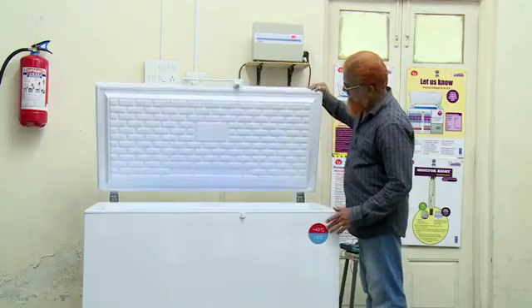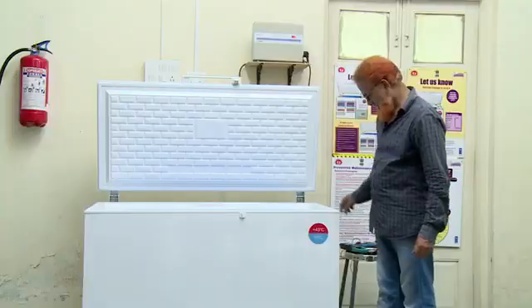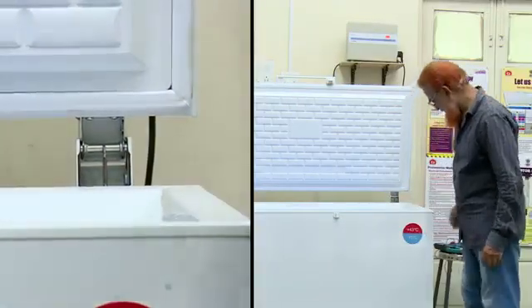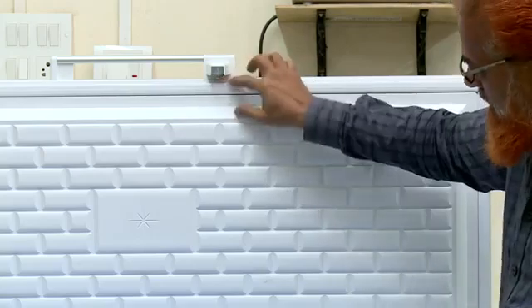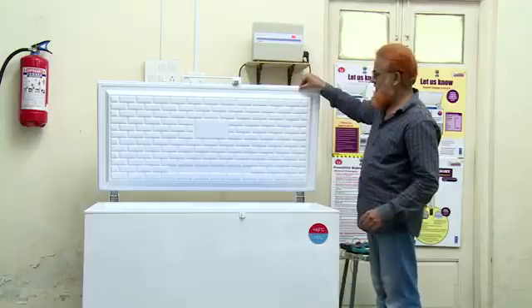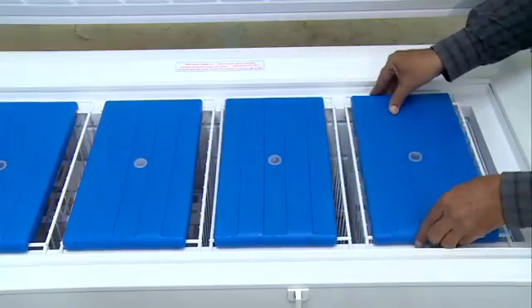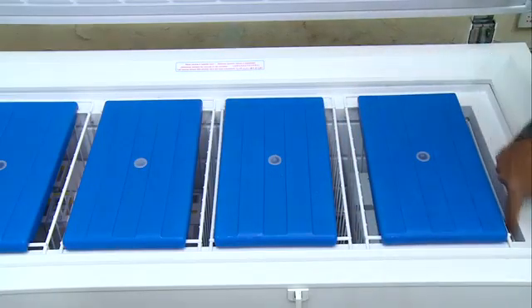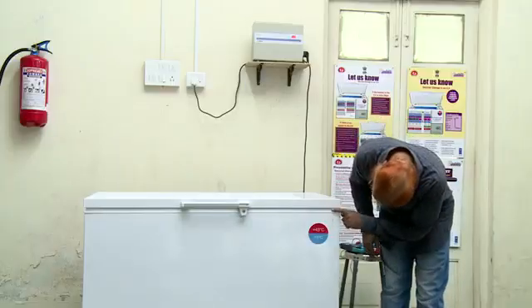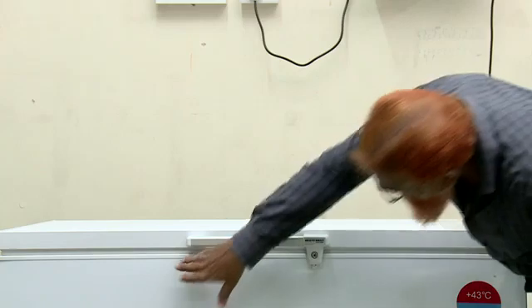Ensure that the top lid is opening and closing properly, and the hinges should be in good working condition. The gasket of the door should be in good working condition. Make sure that the vaccines are kept properly and covered with ice packs or foam. Make sure there aren't any gaps between the door and the equipment, and that the cold chain equipment's door lock is in working condition.